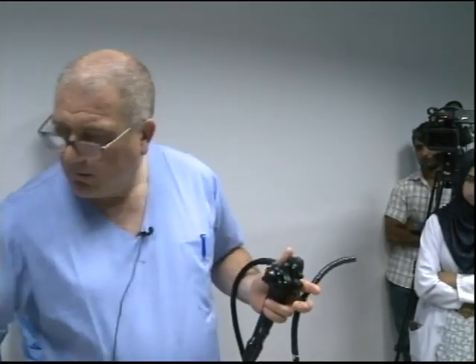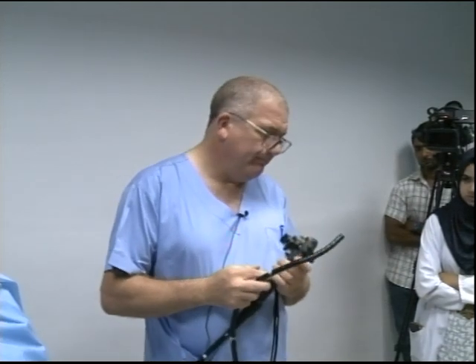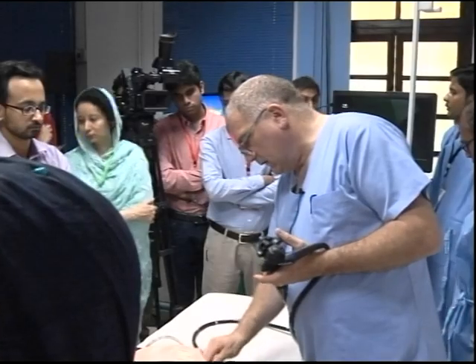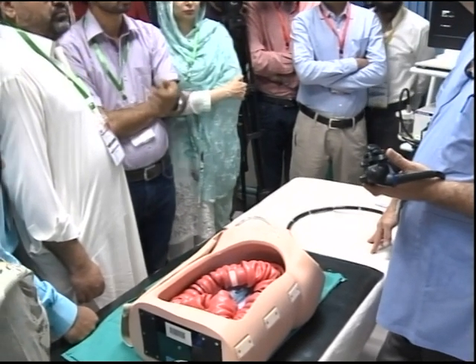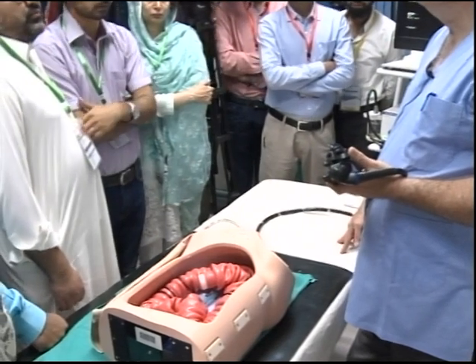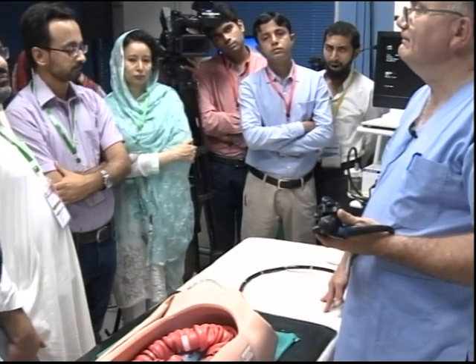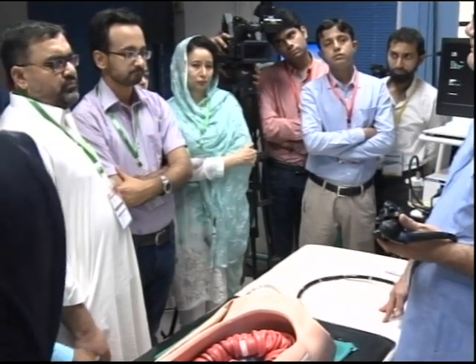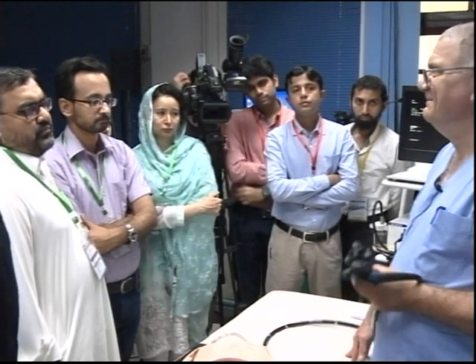Okay? So what I'm trying to get you to do is look at your piece of equipment and resolve. The scope is blowing, but nothing's insufflating. What can be the problem? The scope is blowing. I've got the scope in the bowel and nothing's insufflating. What can be the problem? Channel is blocked. Maybe it is not coming out from the channel. The scope is blowing. Blowing, right. Nothing is insufflating. So what can be the problem? What channel is blocked? The scope is blowing. So what can be the problem?